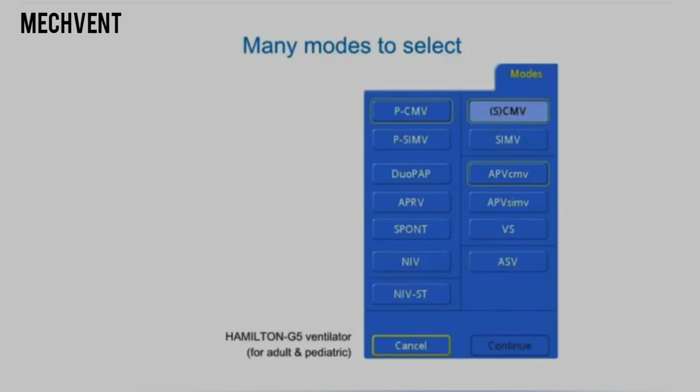Only one mode can be used at a time. When you select a mode, it means that you consider it to be the most suitable for this patient now. The ventilator simply obeys your order. We will discuss mode selection in depth in section 11, bedside mode selection.